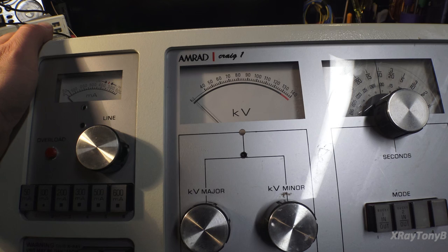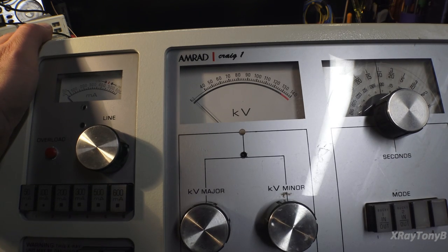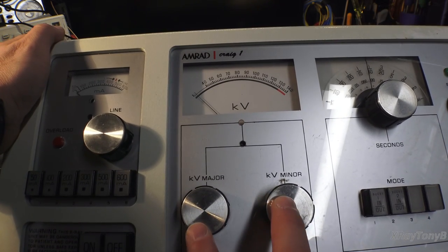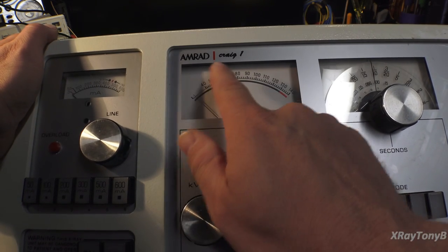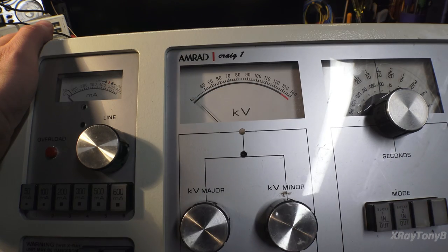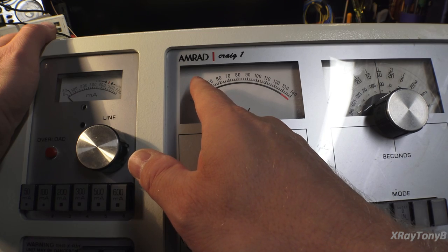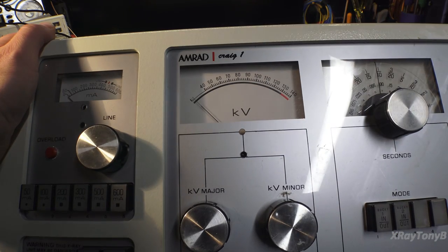Once again, a lot of times we don't call it kilovolts. We call it kV. And 1 kV is 1,000 volts, of course. And that is adjustable by these two knobs. And they're very self-explanatory. kV major will make a big jump in the voltage adjustment. kV minor is for fine-tuning. So as you can see, this machine is capable of outputting between 40,000 volts or 40 kV, all the way up to about 125 to 130 kV.